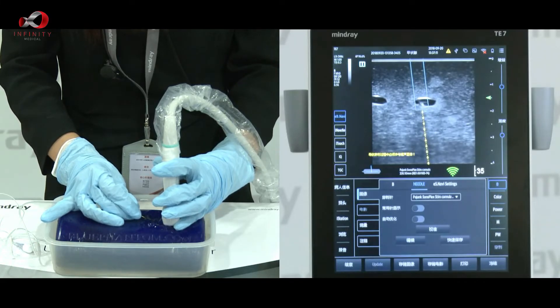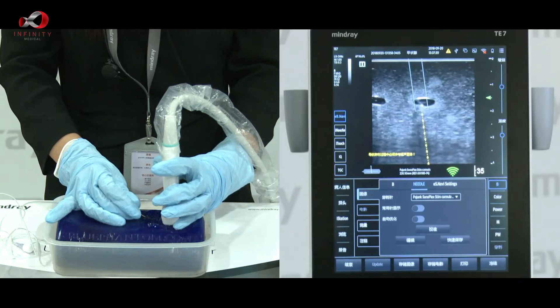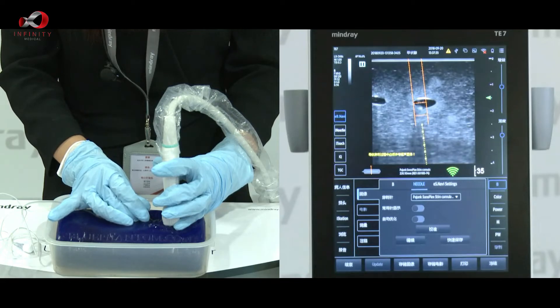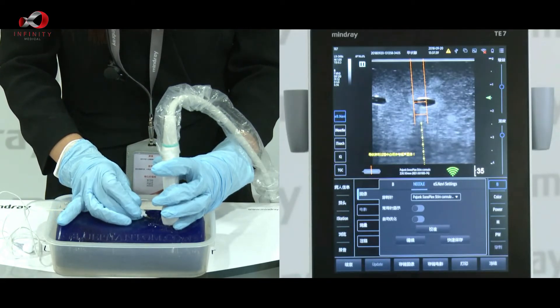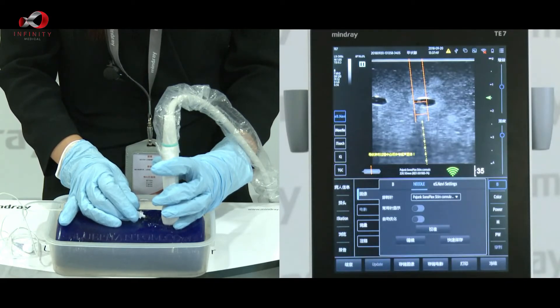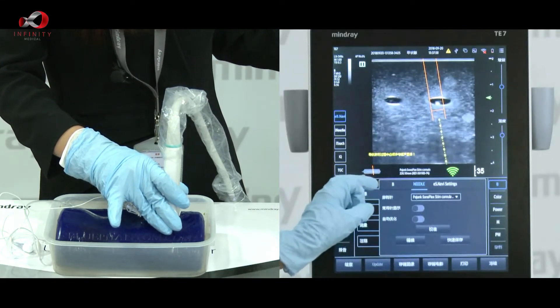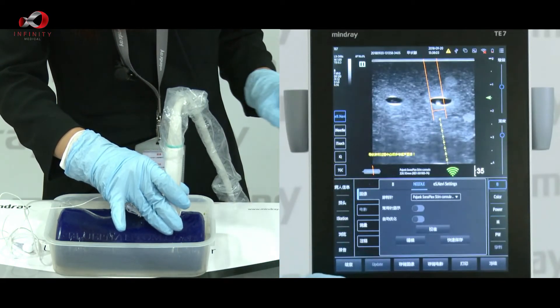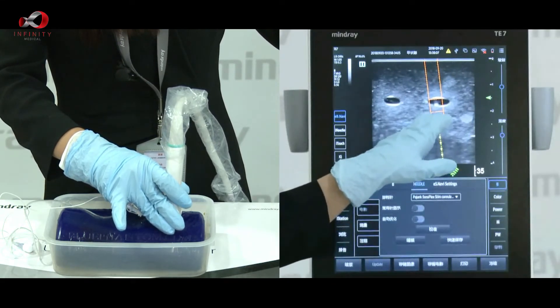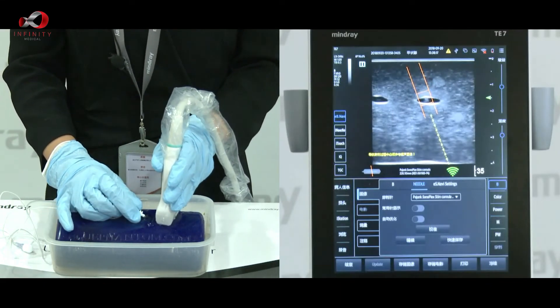When the target box turns blue, it means our needle has already reached our ultrasound plane. Everyone can see the white dot within the cyst, which is our needle tip. When we push forward a little more, the target box turns orange, which means our needle has already crossed the ultrasound plane. On the ultrasound machine, there is an indicator that shows the relationship between the needle tip and our ultrasound plane. The white dot here actually represents the needle body rather than the needle tip.